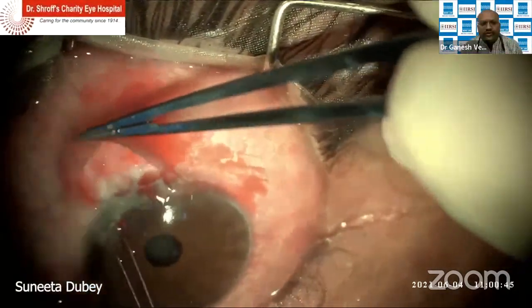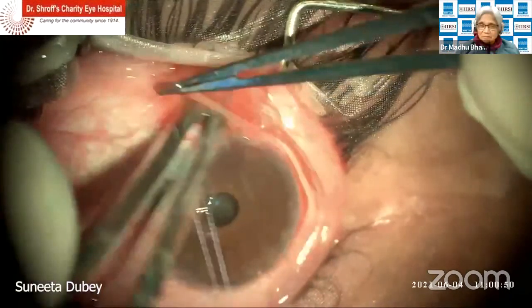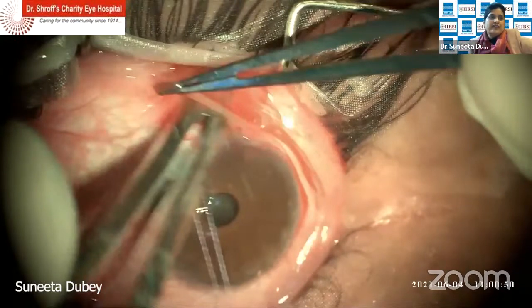So otherwise, what suture would you use for the corneal traction suture? I use 6-0 Vicryl. I can reuse it for suturing the conjunctiva. Yes. But you can use 6-0 Vicryl or 6-0 silk also. Yeah, silk is always good. With Vicryl, they say that there are chances of cheese wiring because it is not a very thick suture. But you can use it and then you can use it for conjunctival suturing.